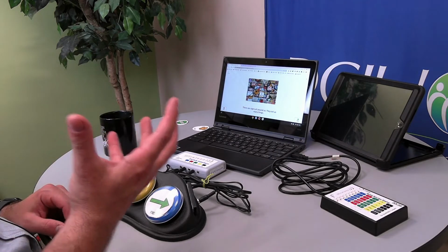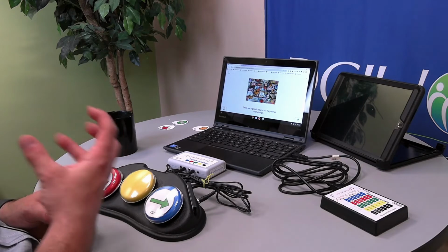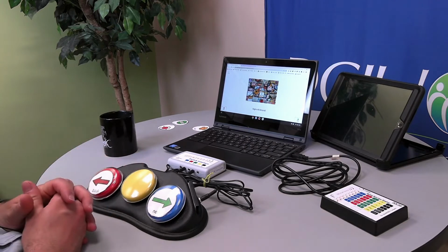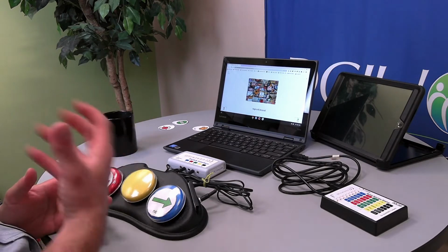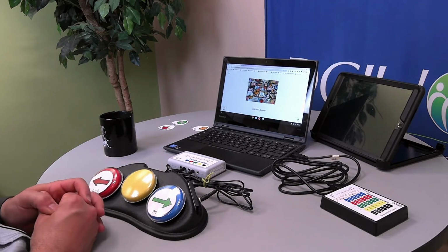Now let's say, for example, the student would like to go back in the story, or we're focusing on that core vocabulary and building that vocabulary for the word back. We've already got the button labeled and it should take us back in the story. So again, this is a great way to encourage core vocabulary with students, as well as just make any types of books or activities on a computer more accessible.